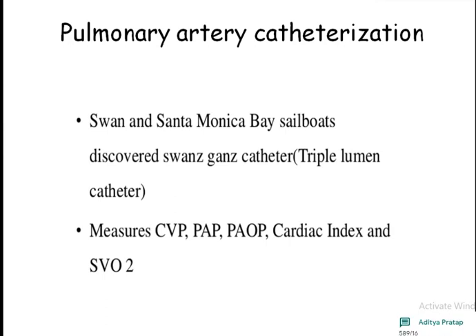There are a number of other techniques through which we can measure the cardiac output with an intra-arterial cannula, that is LIDCO and others. So these techniques have almost become obsolete.